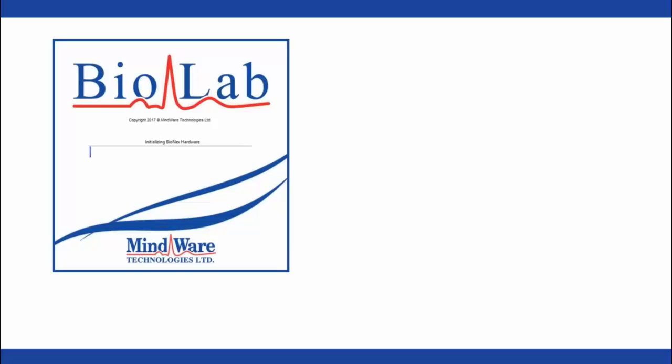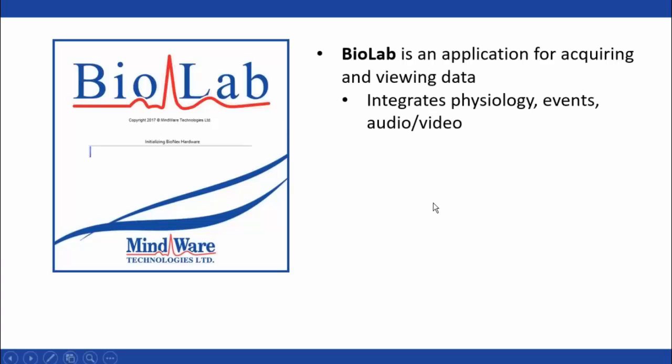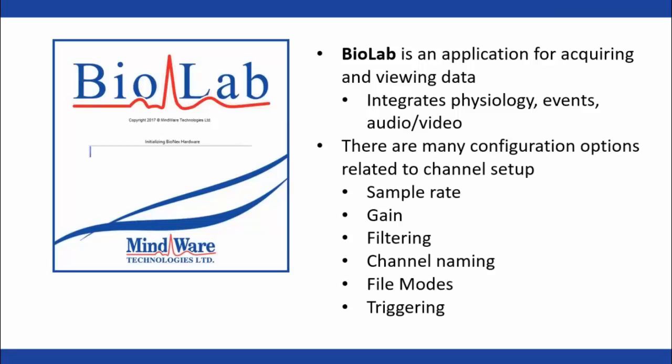What we learned last time is that BioLab is MindWare's application for acquiring data and for viewing data. And using BioLab, you can integrate physiology recording, events, audio, video, and there are many configuration options related to channel setup and general use of the application that we talked about.